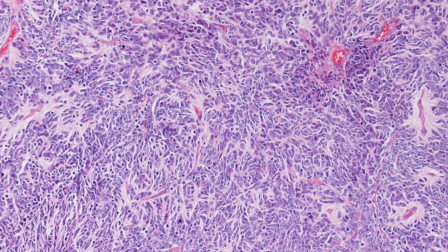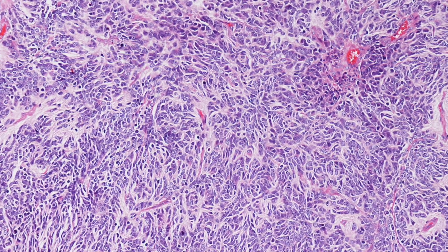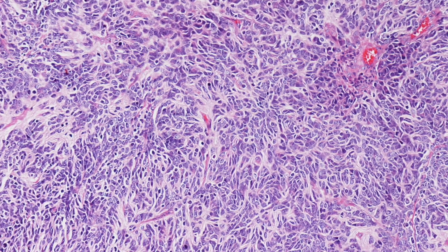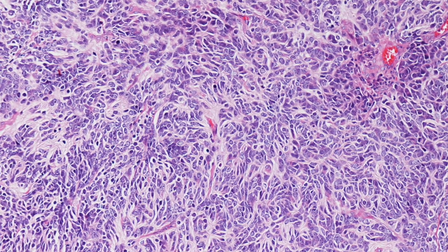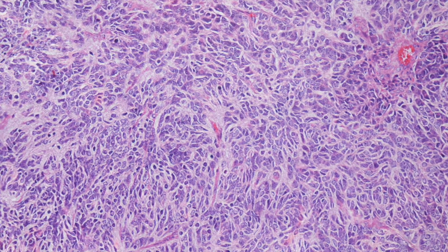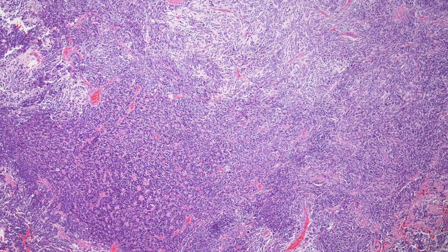Starting with a low power view, and as we move into the higher powers you can see some of the characteristic patterns that this tumour produces.